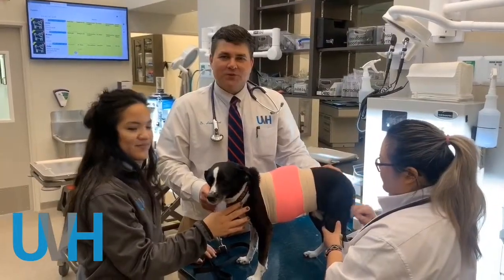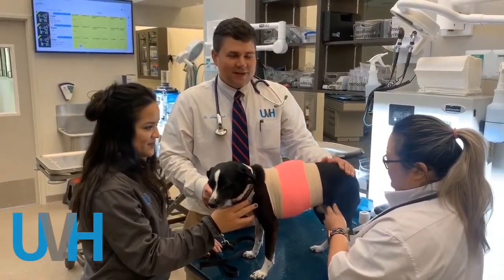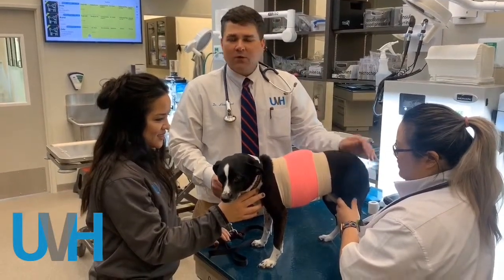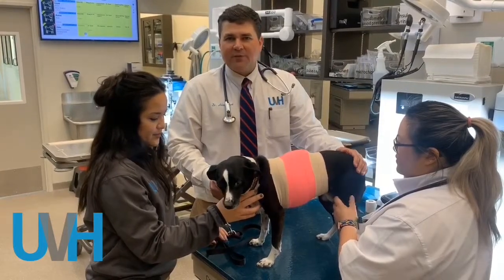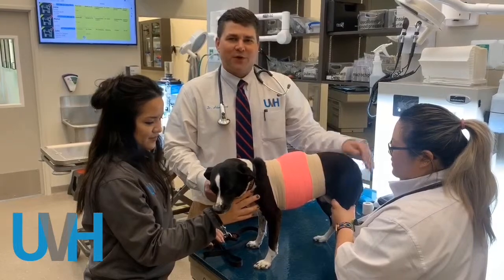This is what our Holter monitor looks like when it's all on — you can see she's just hanging out with her little backpack on, so she'll go home for 24 hours. We'll have the owner record any events or anything strange that she might do with the time on that, and then we'll have a full cardiologist report on every heartbeat for the next 24 hours.